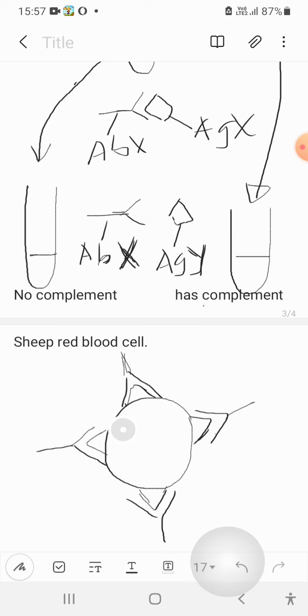This one is antigen, this whole cell. Then there are antibodies attached to it. So it is antigen antibody complex. So if it is put in a system where there is complement system, it will cause activation. So you will add this solution or suspension of this complex into this and that. You'll add it to this test tube which has no complement and this one which has a complement.